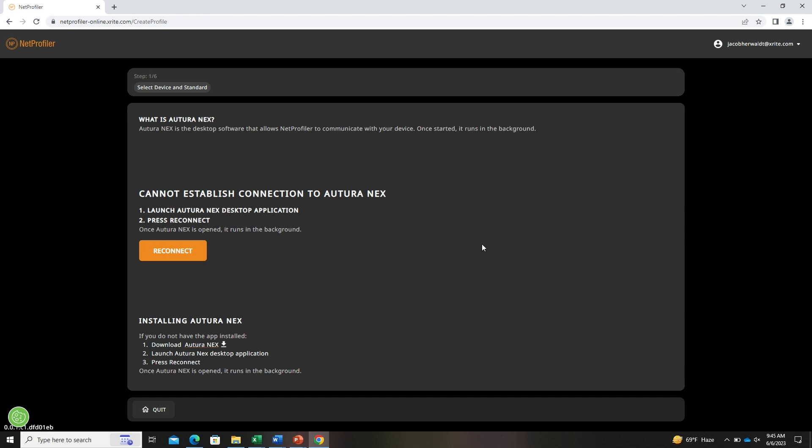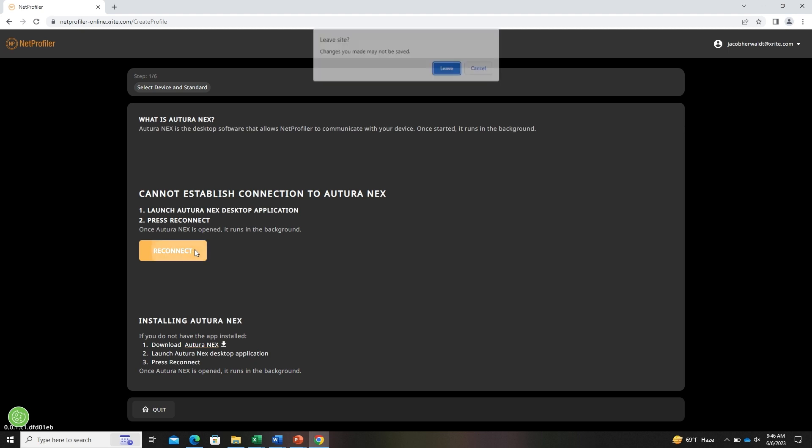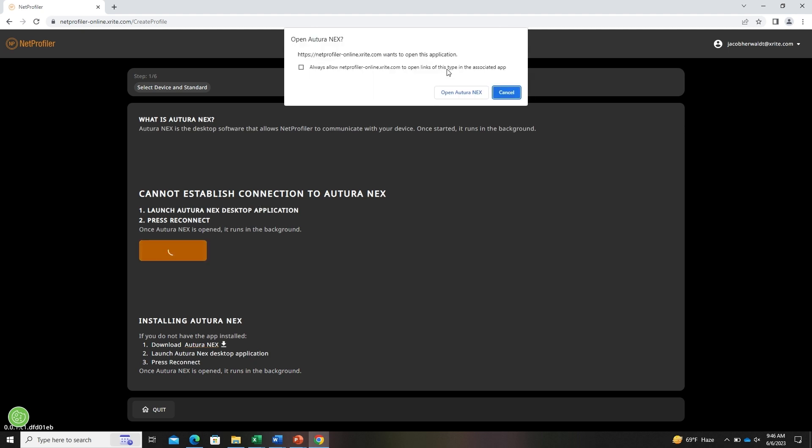Next, you'll need to download Turanext if you do not already have it installed. Once launched, it runs in the background and allows the device to talk to NetProfiler online. If you already have Turanext downloaded on your computer, you can click the reconnect button which will launch Turanext.